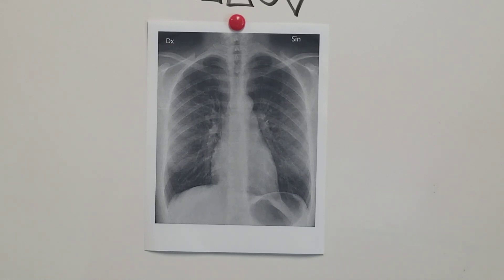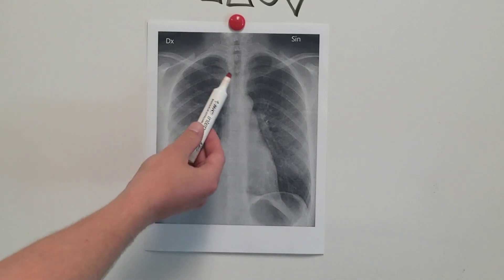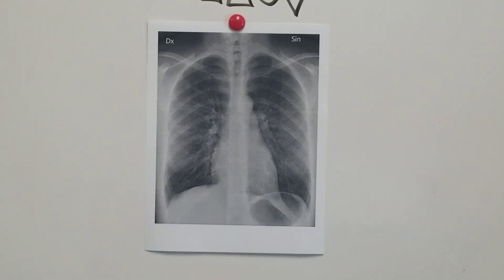After D comes E — echo, that's for extra things. E is for extra. You're looking for an ET tube, an NG tube, a PICC line, a central line, foreign bodies — of which this patient in this picture does not have any.